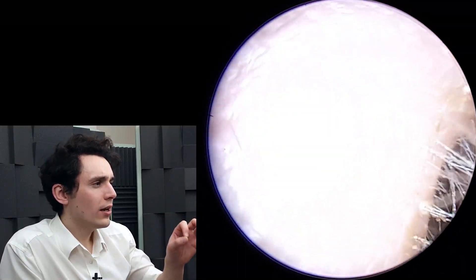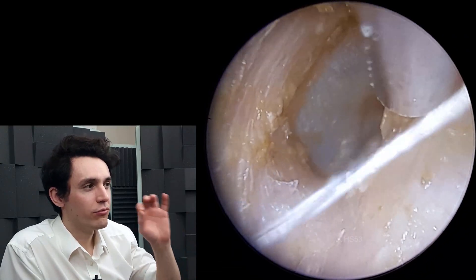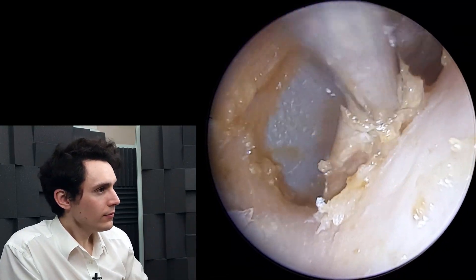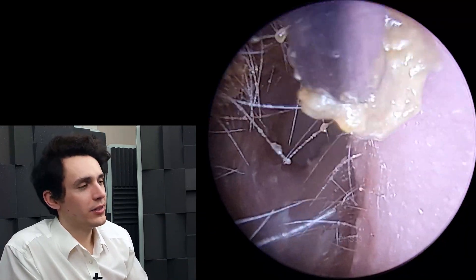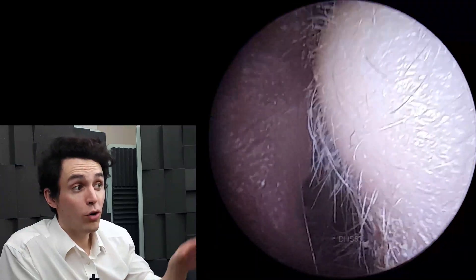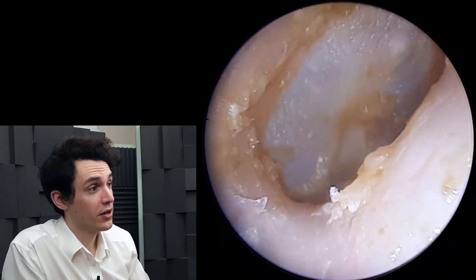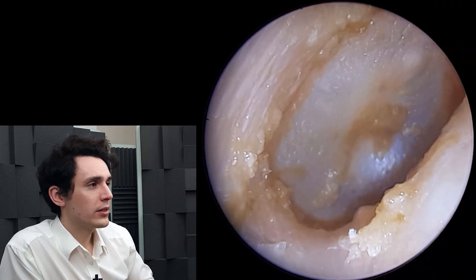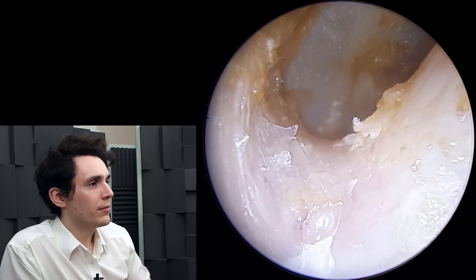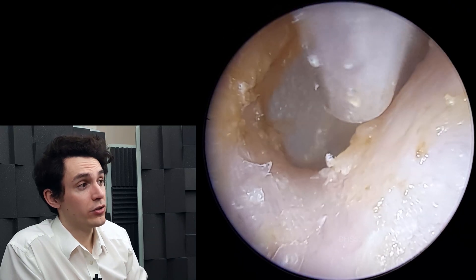So there's just one last sheet of dead skin that I want to remove here, and it's hidden right back there. And there it is. It's often very difficult to see what's actually trapped in that recess, and probably there are some little bits and pieces back there that we can't quite visualize with the endoscope. But there it is — get a nice look at the eardrum. There's some residual slime and wax on the eardrum, but next time the patient goes for a shower, all of these residual little smatterings will be resolved.